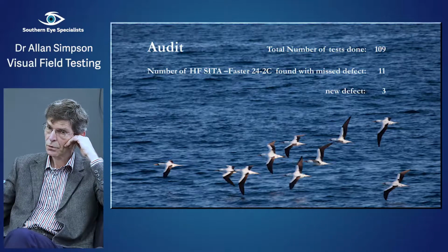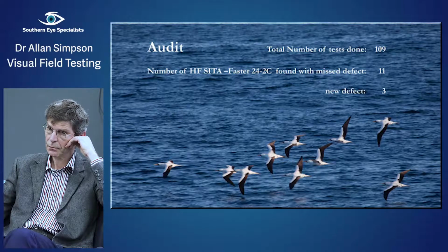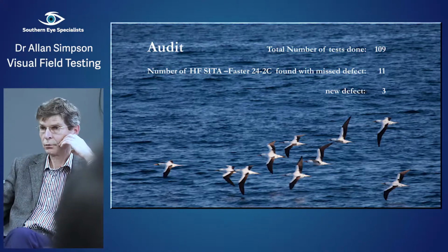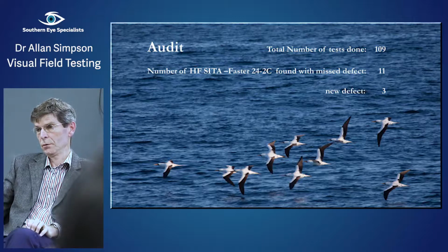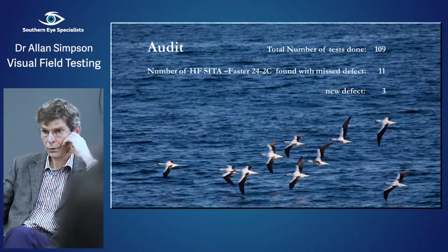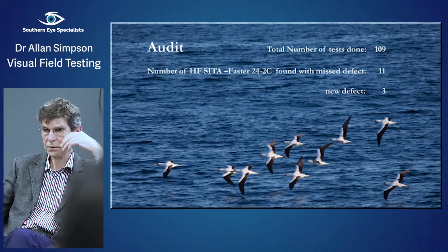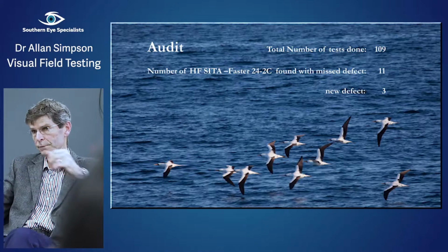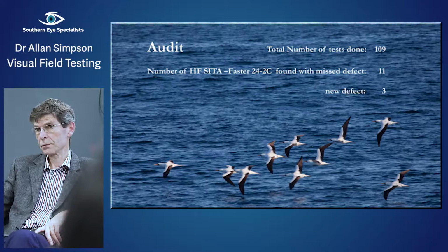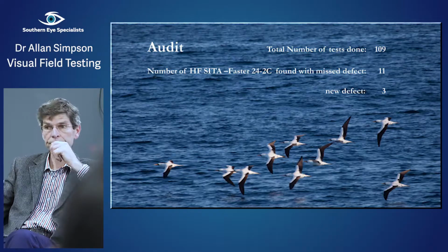But it's also not uncommon to get a significant OCT loss that doesn't show up in a visual field, just because so much structural change happens before it starts to show up on the field. But yeah, it certainly was a little bit worrying when I first saw those, thinking that maybe we're missing the earliest changes in the field test, and maybe you're picking up that first field loss a little further down the track by this new test. So that's something to keep in mind.